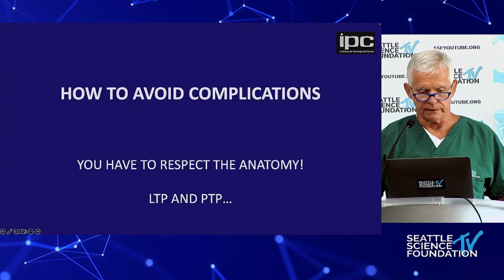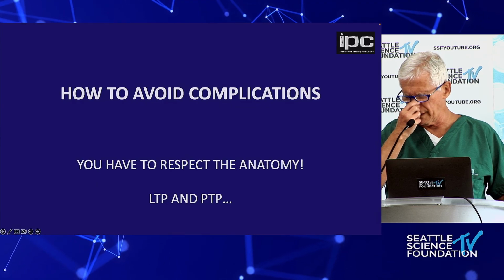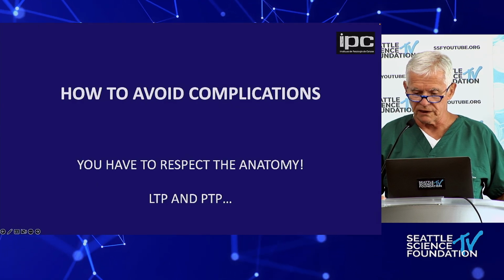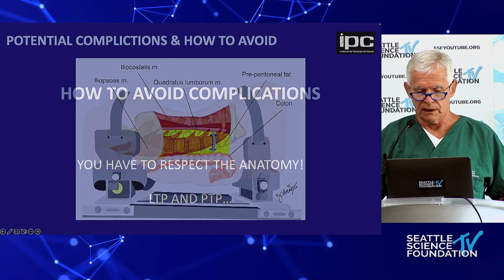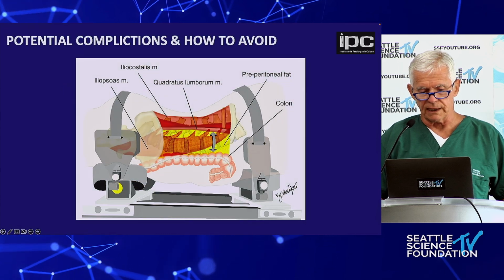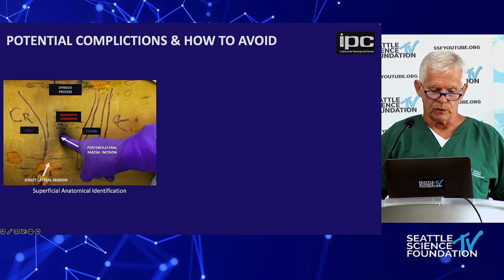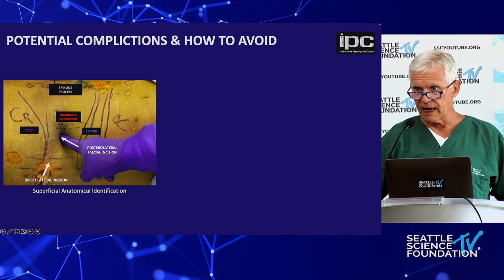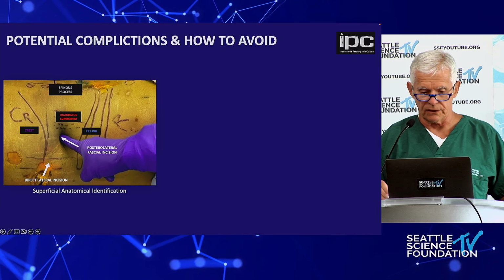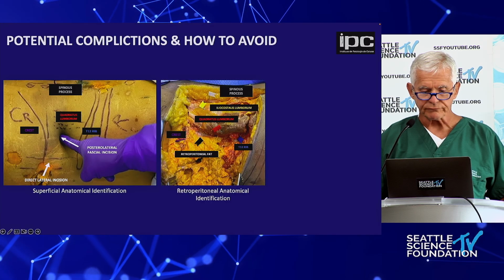This is important for showing the risk that we face, but how do we avoid it? How we avoid hitting the bowel is basically learning where the bowel is. We did a study in cadavers in which we placed guide wires, before cutting anything, in the direction of the 50-yard line.